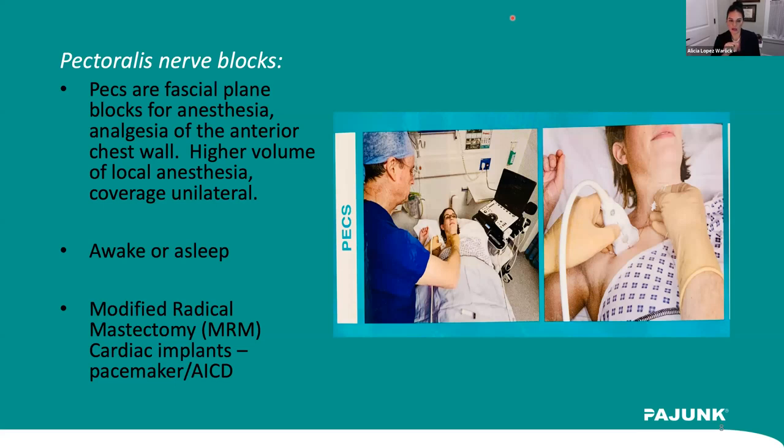Now let me just comment on the awake or asleep. I get this question sometimes, and maybe I can help some people here understand my reasoning behind doing this awake or asleep. Remember that the fascial plane blocks, you can do these asleep, right? They're not perineural blocks, and it is okay to have a patient asleep while you're doing a fascial plane block. You choose either one, and sometimes your system chooses for you, right? So in an academic center, you're probably doing these awake in the pre-op area under sedation, right? Some of these women, like I showed you in the beginning of this talk, are very anxious. There's a lot of anxiety around breast surgery.